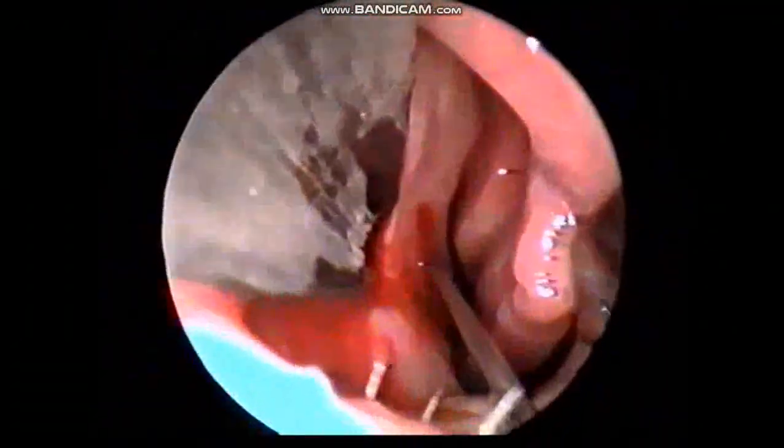You can see I am injecting the local anesthesia into the anterior part of the nasal septum and also into the nasal septum posteriorly with a long needle. The infiltration is given from anterior to posterior on both sides of the septum and also on the floor of the nasal cavity. There you can see local infiltration into the posterior part of the bony septum. The mucosa there.